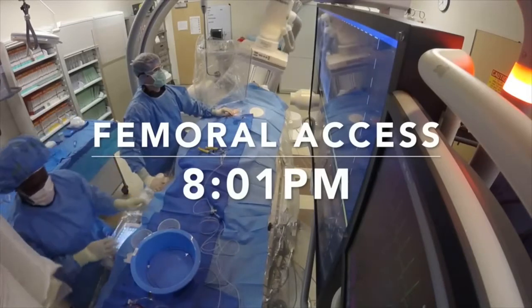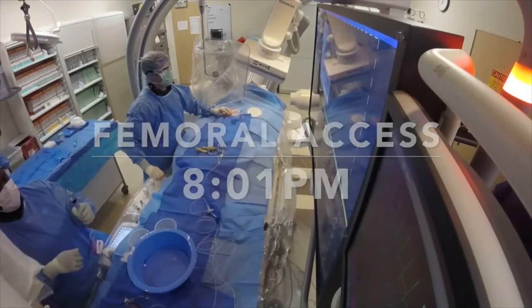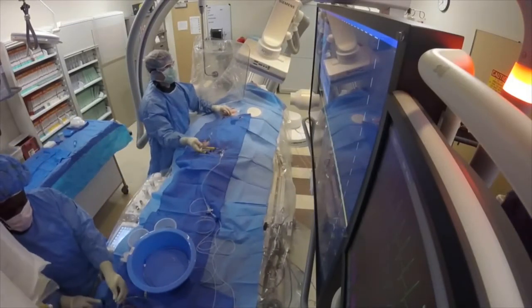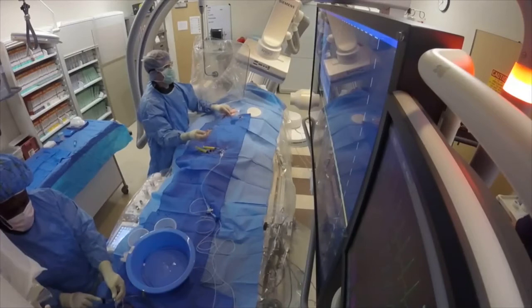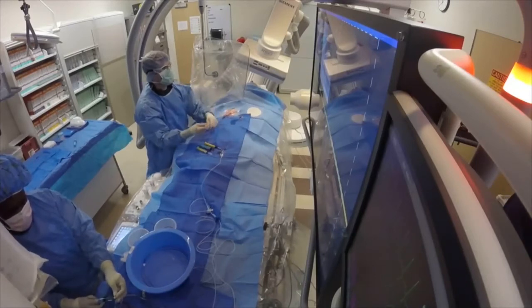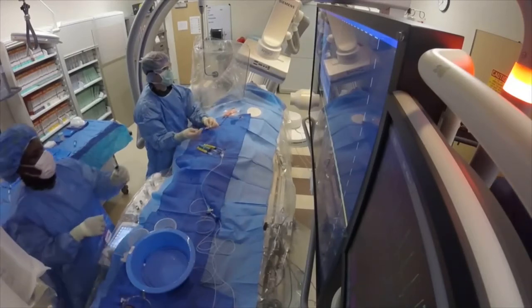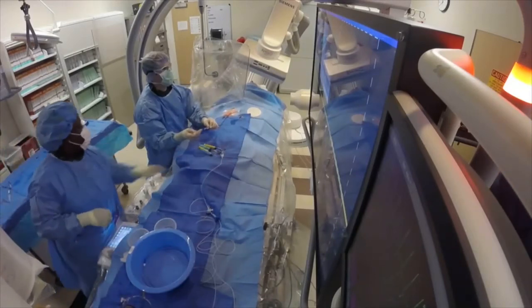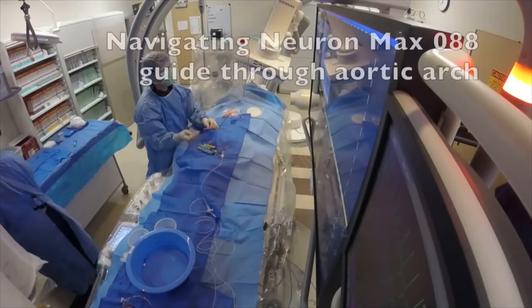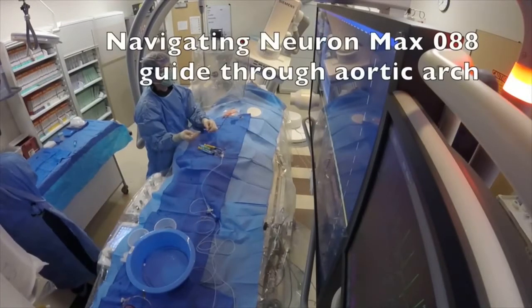Now we're looking at the actual angiogram and thrombectomy. We've just gotten access into the femoral artery. We're putting one of the main catheters up into the aortic arch and we're trying to get that catheter into the right common carotid artery.